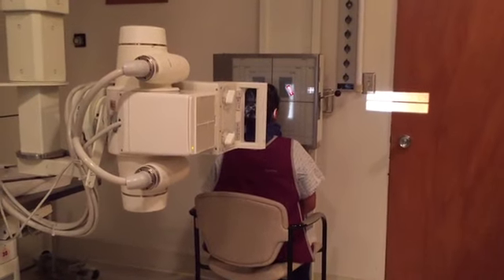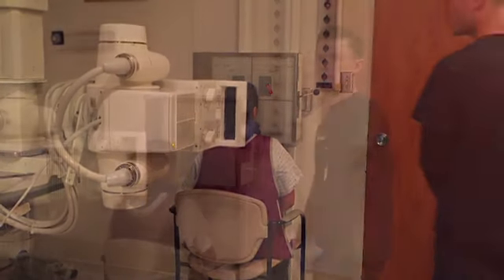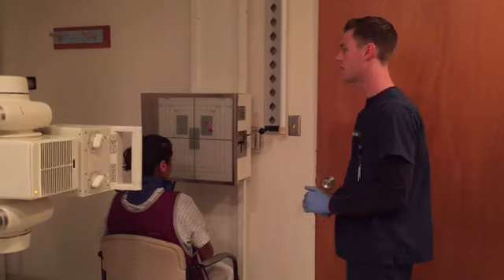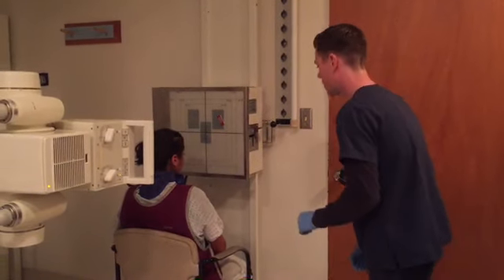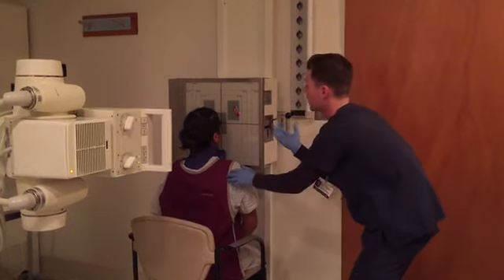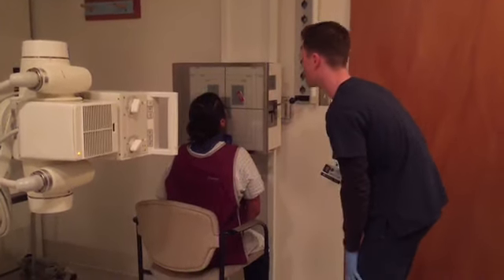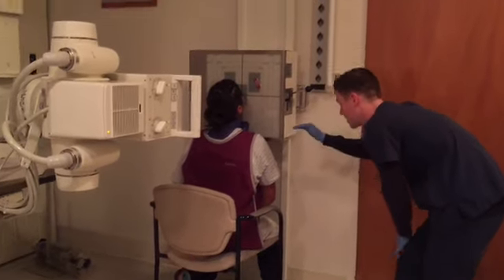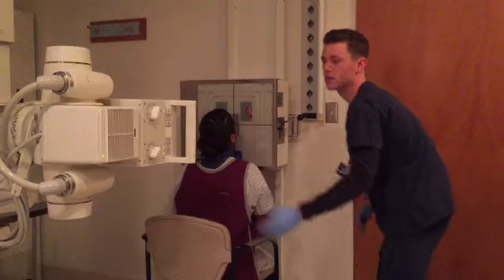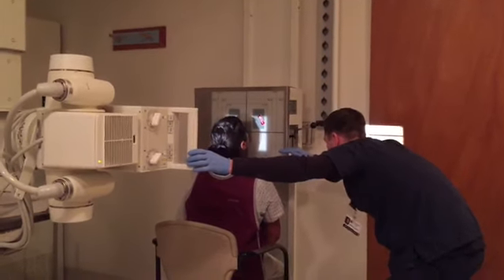Alright, Evelyn, go ahead and hold your breath. Don't move. Expose. Alright, go ahead and breathe. Okay, now that I've performed my PA axial projection, we're going to move on to the Waters view. So I'm going to have her put her face up against the IR again, tilt the head back. You want the OML to form a 37-degree angle to the IR. This puts the MML, the mentomeatal line, pretty much perpendicular to the IR, which we are pretty good right now where we're at.